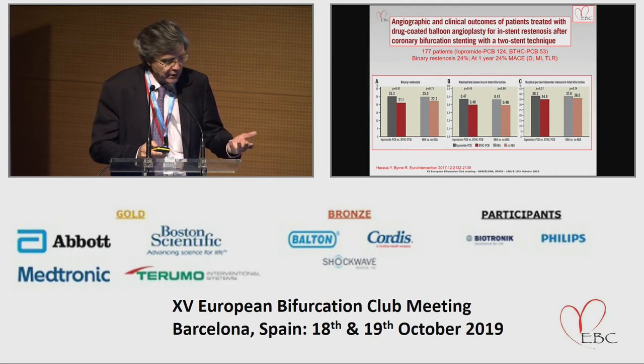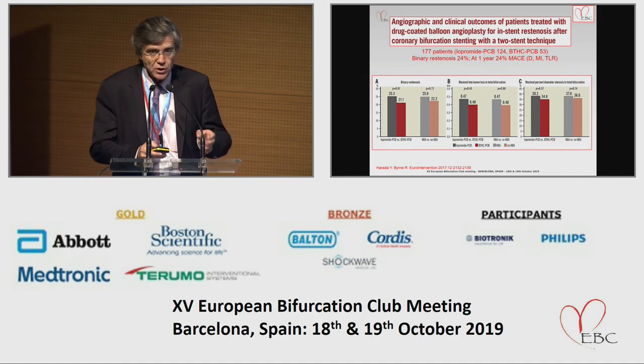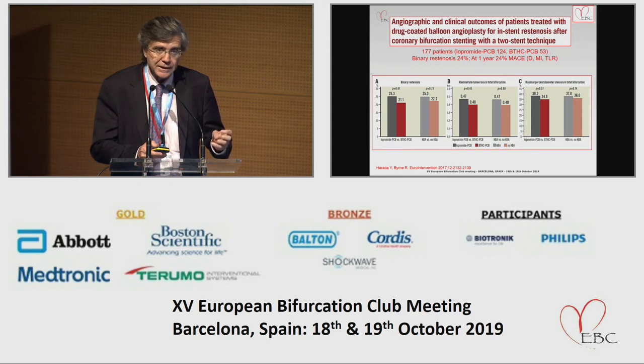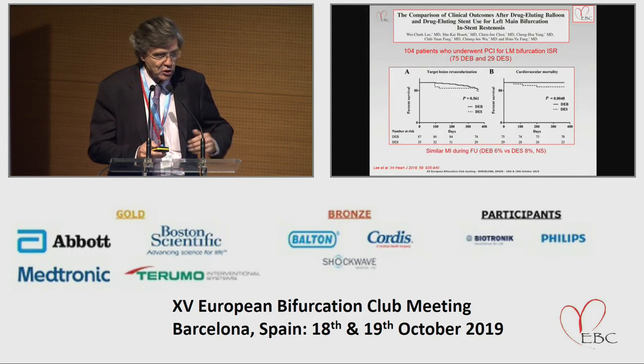There were no differences according to the specific type of drug coating balloon used, and this study is interesting because they also obtained systematic late angiographic follow-up, as you can see here, and other technical issues, such as final kissing balloon inflation, did not change the prognosis of these patients.